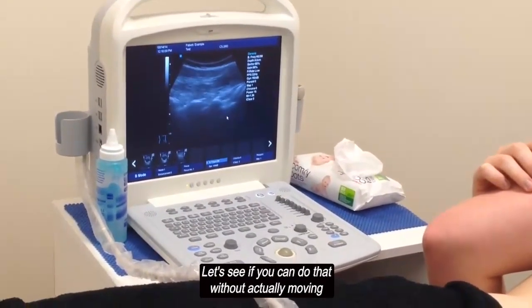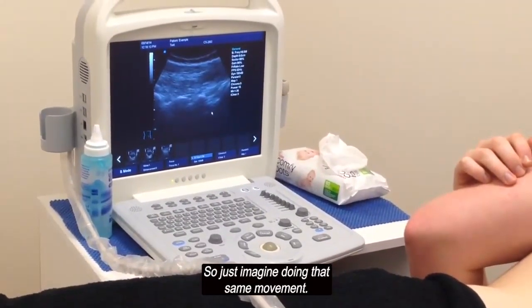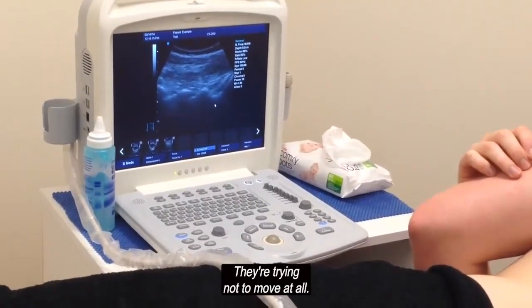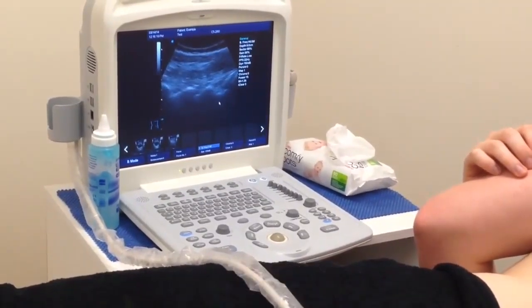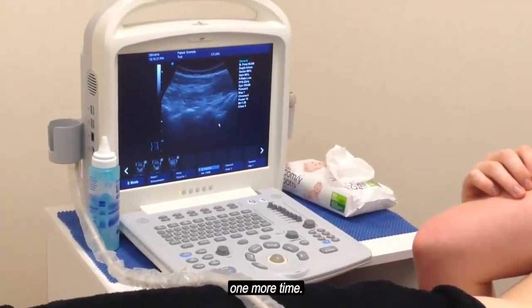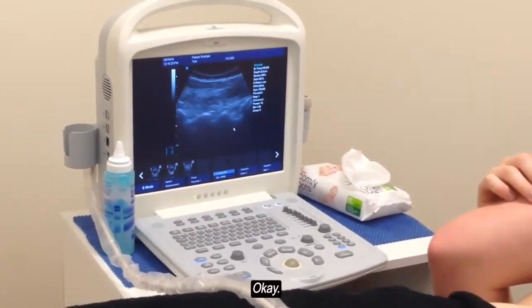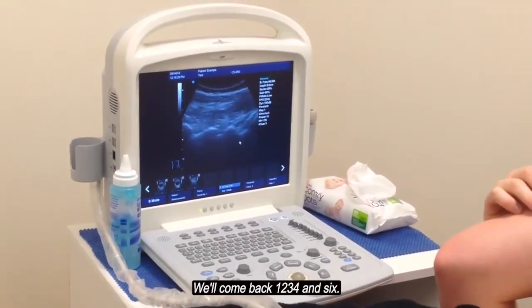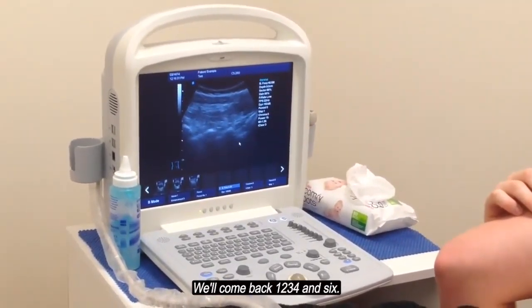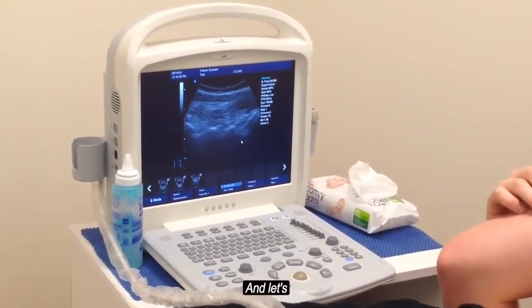Let's see if you can do that without actually moving your hips. So just imagining you're doing that same movement, but try not to move at all. Yeah, good. So we've got a nice gentle muscle contraction there. One more time. Perfect. Let's just see how long you can hold that on for as well. So just switch on, we'll count it out. 1, 2, 3, 4, 5, 6, and relax.